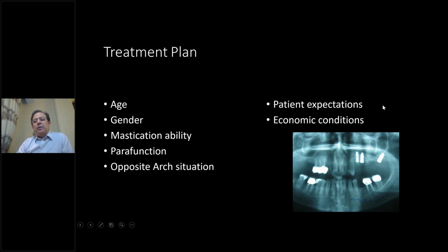The accessory factors are also about the patient's expectations and economic condition. For example, in some elderly patients who are scared of the sinus lift, we can put the implant in the anterior and posterior wall of the sinus with more angulation and correct it with the prosthesis.